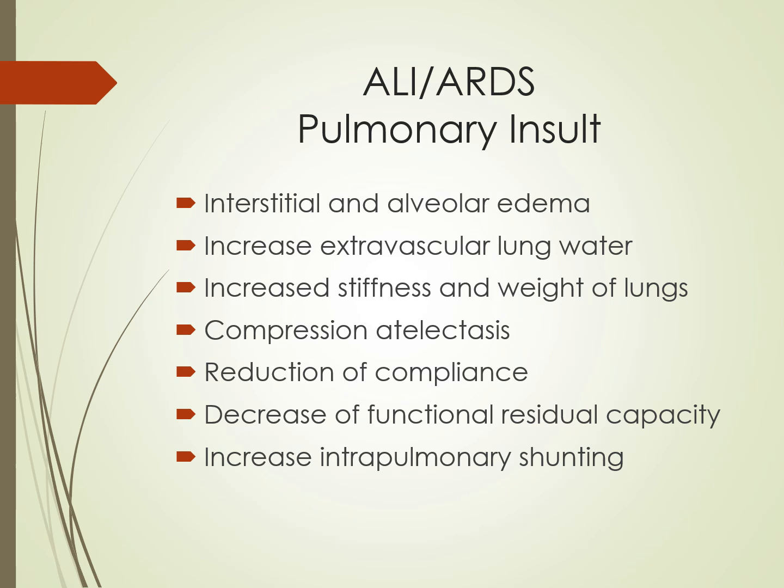We always used to measure compliance every day on our patients to make sure if they were getting better, getting worse, or plateauing. Also, there's a decrease in functional residual capacity, which equates to poor oxygenation. And there was a lot of intrapulmonary shunting, which, again, is a problem for the oxygenation of the patient, tissue oxygenation.